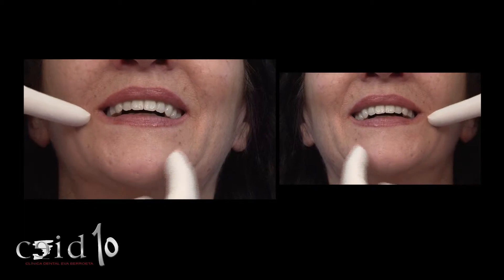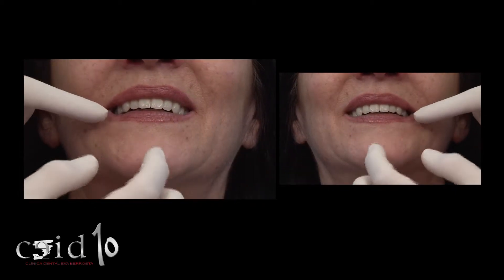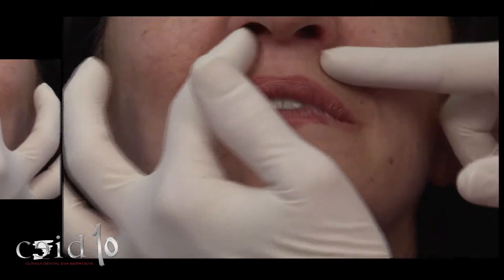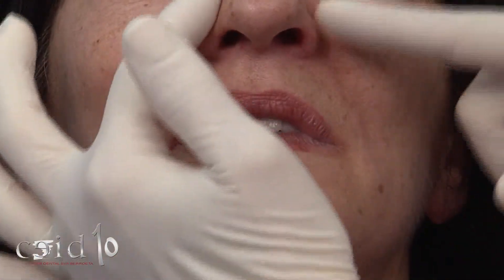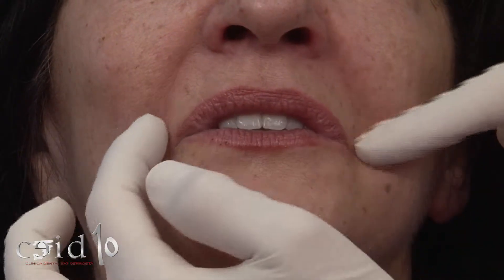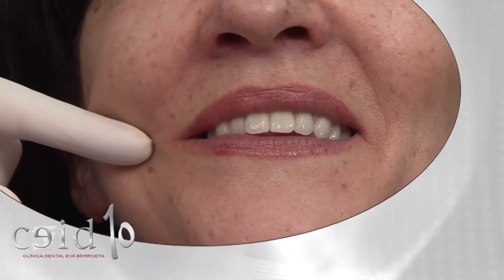Al sonreír, nos fijamos en que haya lo que se llaman en las comisuras estos espacios negros, estos triángulos que hacen la sonrisa más natural. Y si os fijáis en el reposo, cómo hemos conseguido rellenar todo este labio superior y todo este tercio facial — lo hemos aumentado. Así hemos disminuido las arrugas del labio superior y el efecto en general es espectacular.